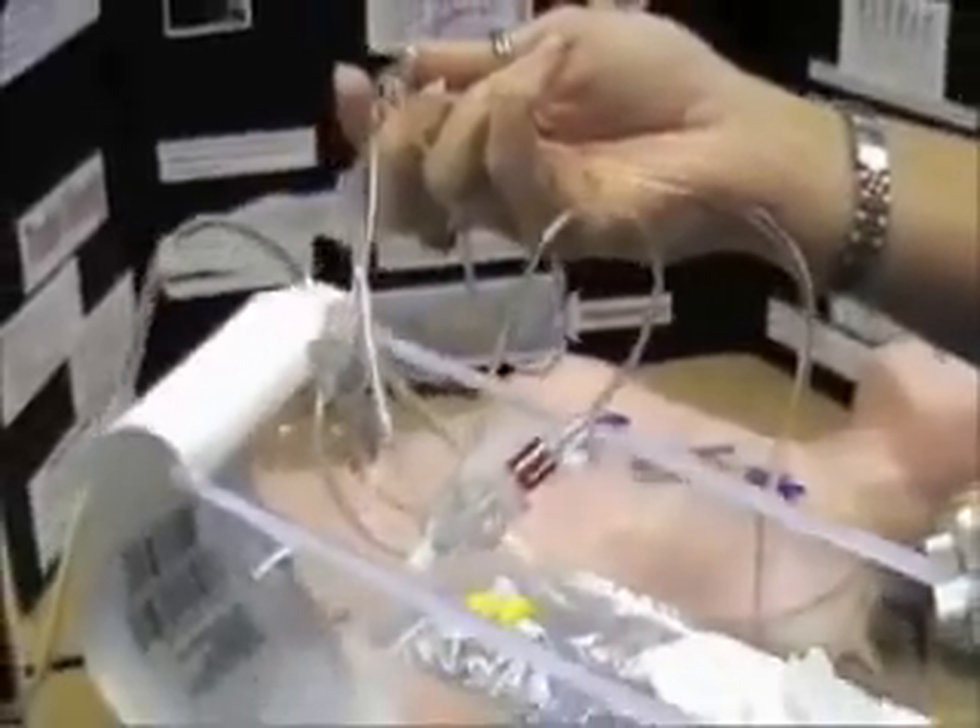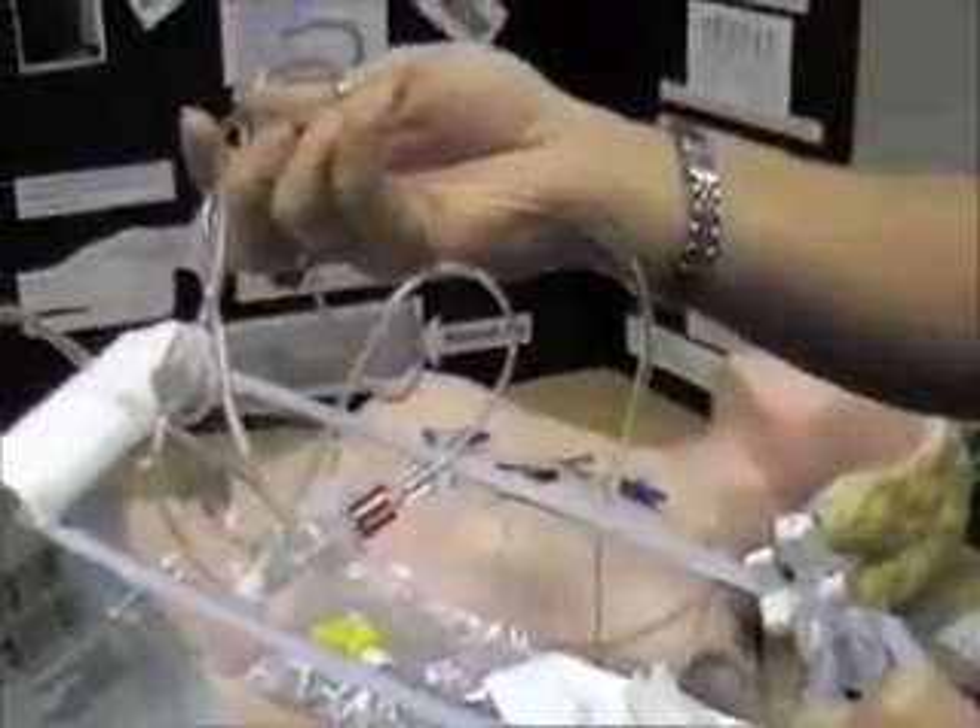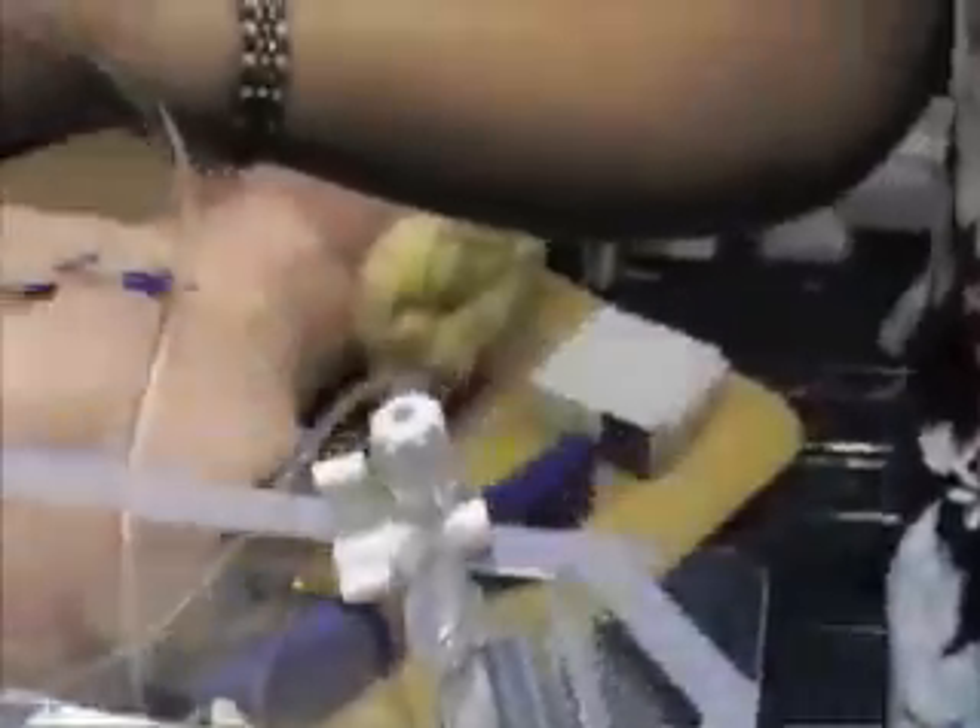To prime the tubing, you need to turn the stopcock off to the patient, squeeze the little white tabs, and get all the air out of it. Then you're going to turn the stopcock back off to the port, opening it up to the patient, and prime all the way through the end by squeezing the white tabs. Some catheters have a little blue pulley that you pull on, but it's usually right under the transducer.